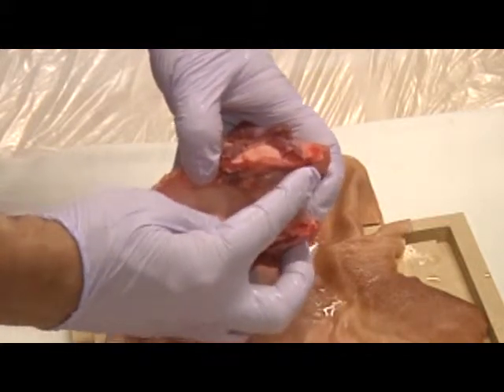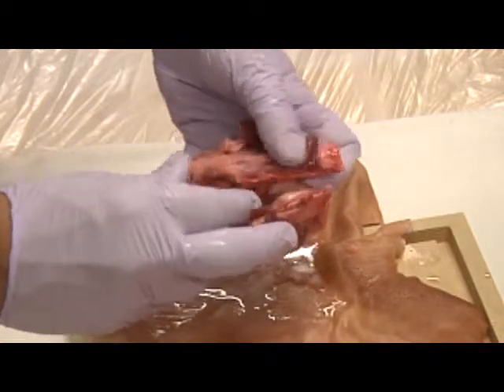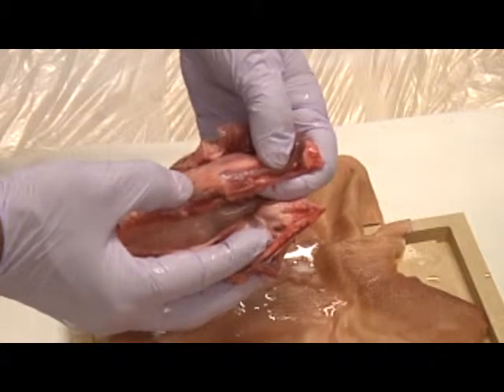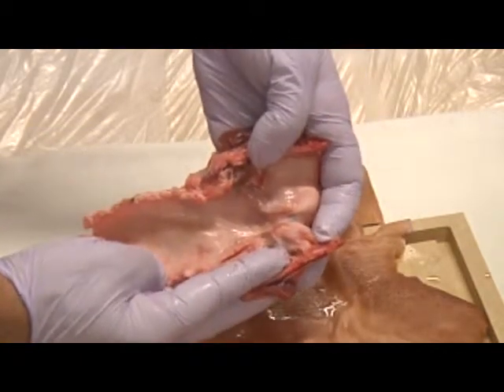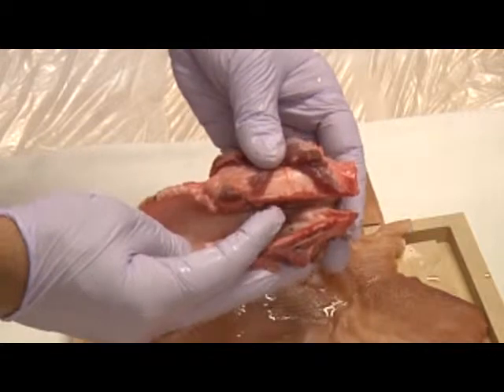You can see that the thyroid cartilage is actually about 5 centimeters in length, much longer than the human thyroid cartilage. We then have the cricothyroid membrane, where my thumb is, which will be our target, and then the cricoid cartilage below. And you can see we have a nice wide open patent larynx and trachea in this model. Of course, this particular specimen will not be useful for the workshop.